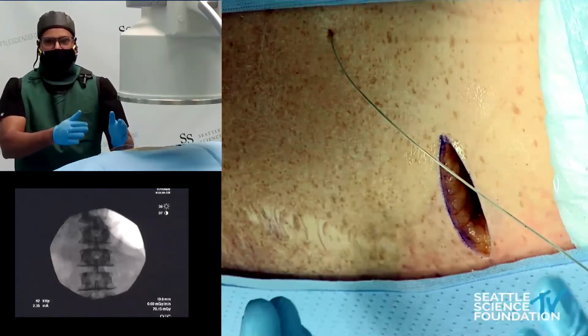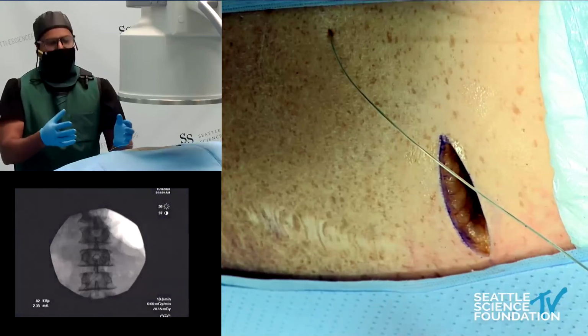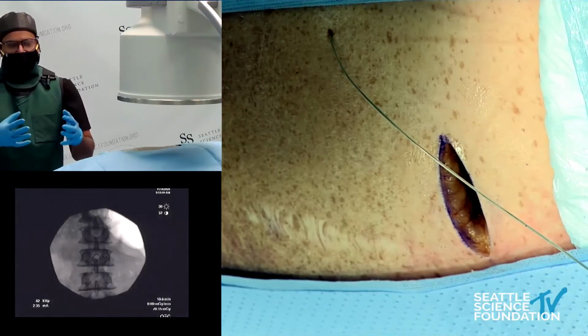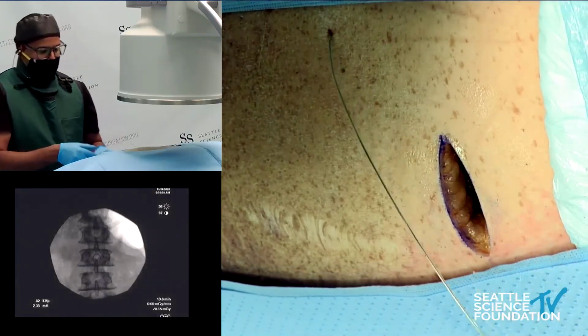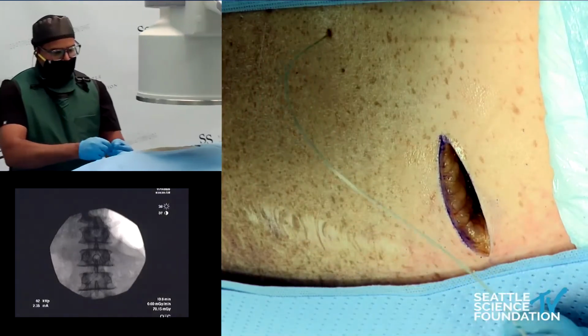So you really want to do a good job here because infection is one of those more challenging things to control. You can do a lot to control migration, you can do a lot to control lead fracture, but infection is one of those bugaboos you really have to be meticulous about to make sure you don't have them, even though, if you're doing enough of these, you're going to see an infection in your lifetime.